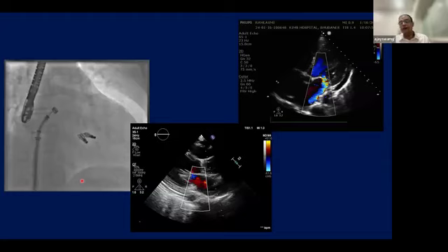The LV also becomes less commodious because of the regurgitant fraction, which was earlier filling back from the LA into the LV. That also becomes less. So that is part of the beneficial remodeling of the LV that occurs after the reduction in the grade of MR. But you cannot reduce the grade of MR at the cost of increasing the LA mean. And that's the hemodynamic achievement that you have to get with a good quality mitra clip procedure. So that's the best answer that we can give.